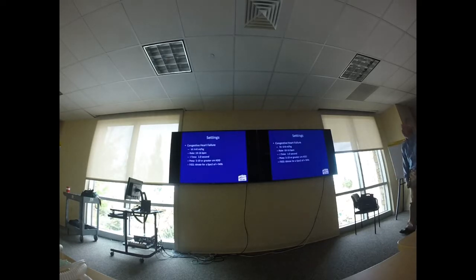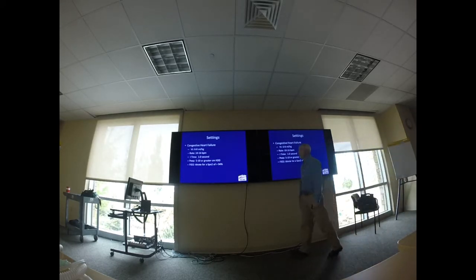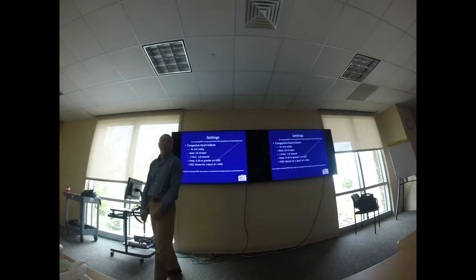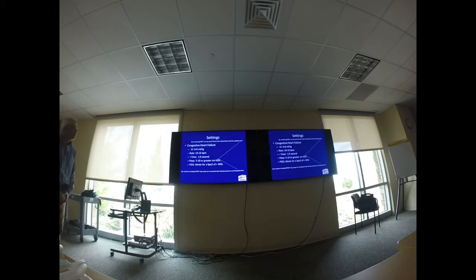So, congestive heart failure. It really isn't that much different than normal, in my opinion, right? So I would do 6 to 8 cc's per kilo, rate 10 to 16, I time of 1, PEEP.